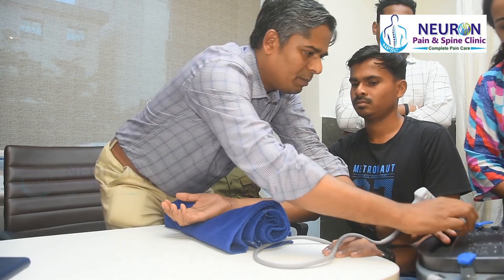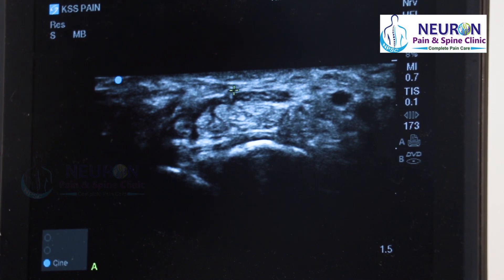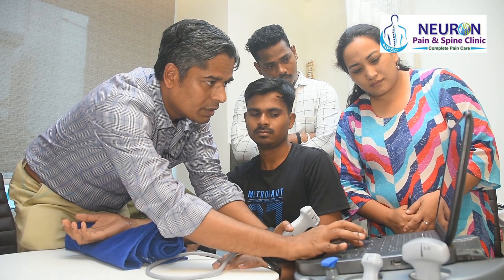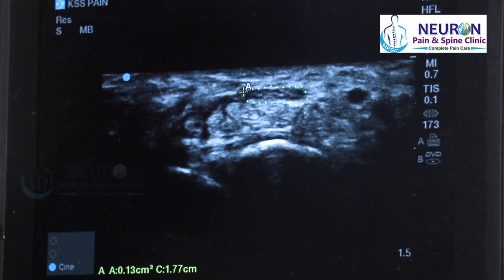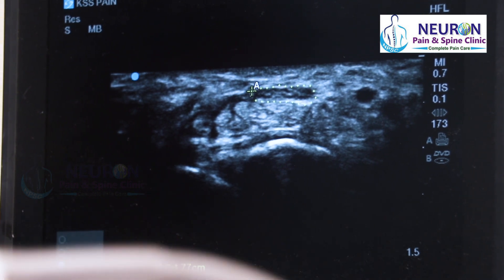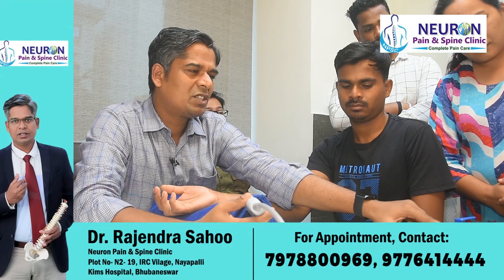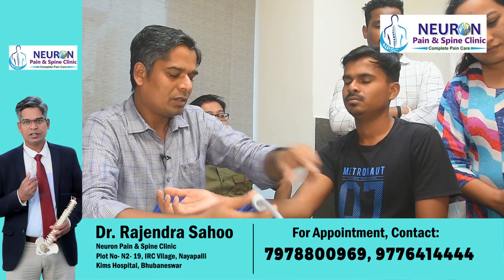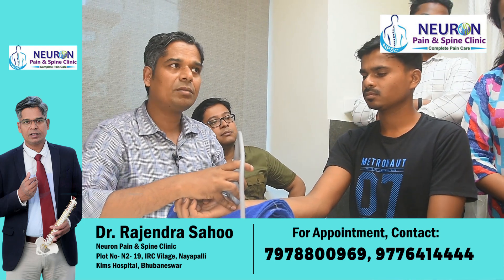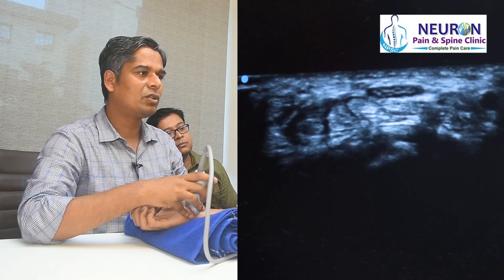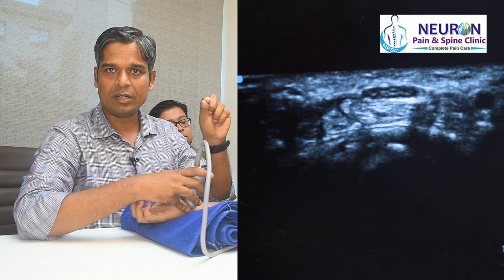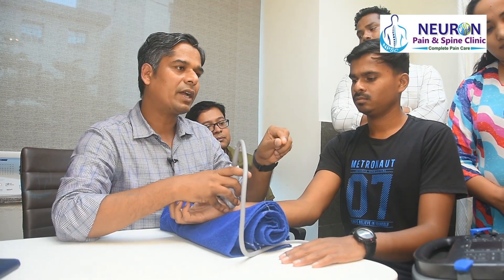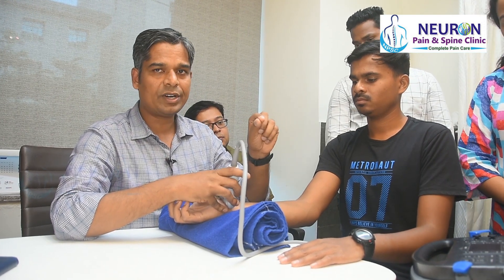At the distal wrist crease, I'll take the image, freeze, go to my caliper — manual — and try to measure the cross-sectional area of the nerve. This came out to be 12 to 13 millimeter square, which is suggestive of carpal tunnel syndrome. Normally the cross-sectional area of the nerve is less than 9 or 10 millimeter square. For carpal tunnel syndrome, in addition to symptoms, the nerve cross-sectional area has to be more than 11 to 11.5 or 12 millimeter square — that is definitely carpal tunnel syndrome, mild variety. When it is more than 14 we call it moderate; more than 14.8 or 15 we call it severe form of carpal tunnel syndrome.